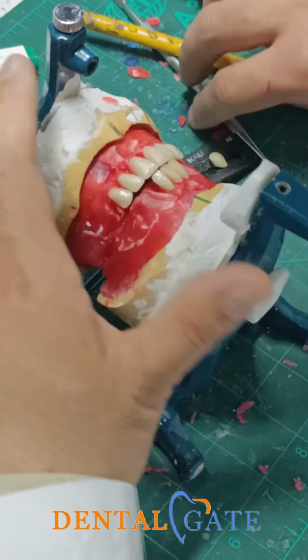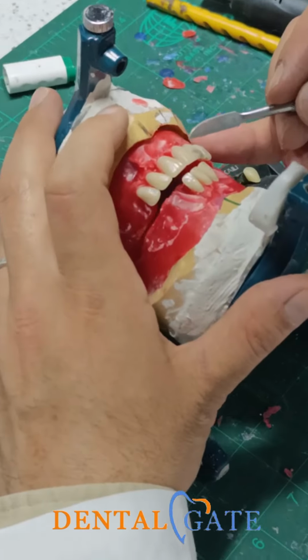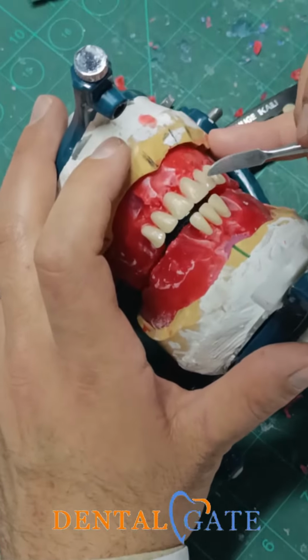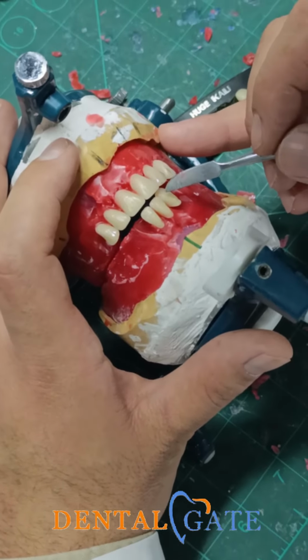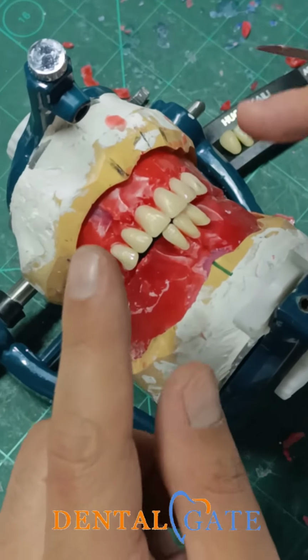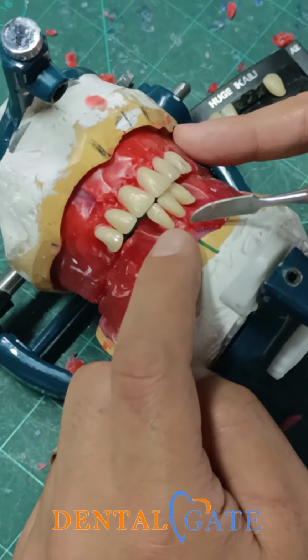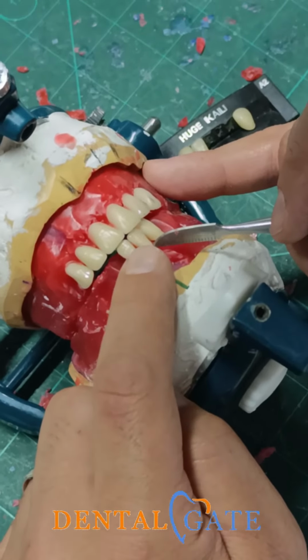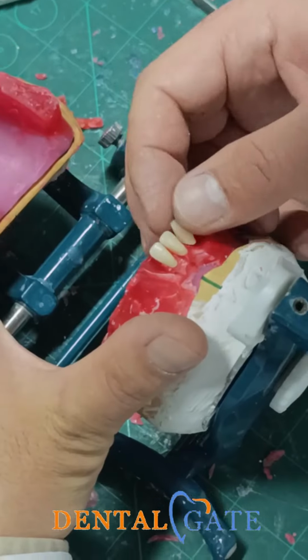One lower, 2 upper. You can see the central and the lateral will be occluded with the 1. Why? Because we have a difference in width. The width of the upper central is not the same as the lower central, so these rules are generated.